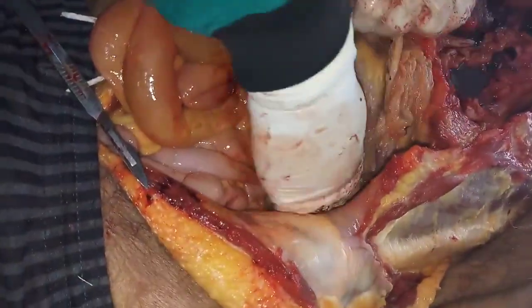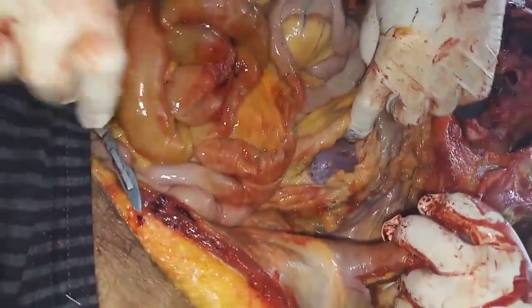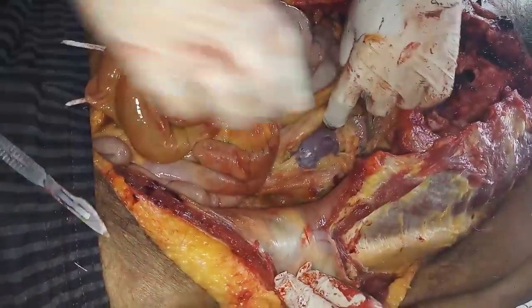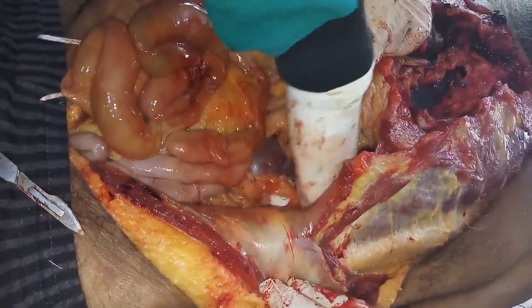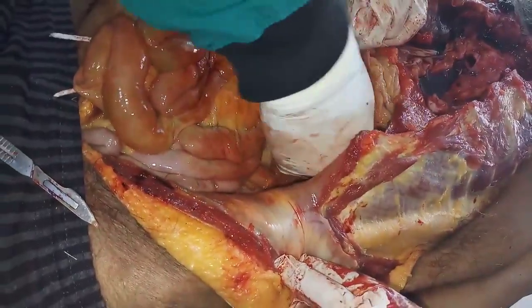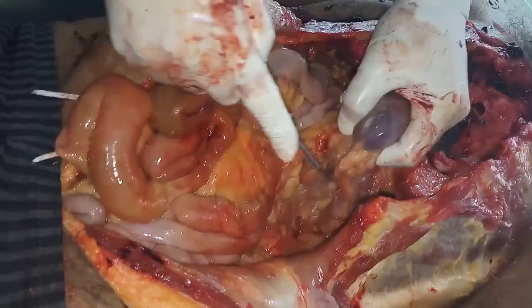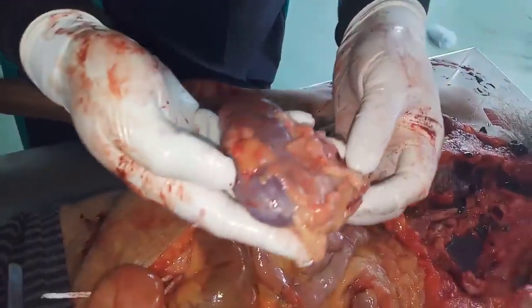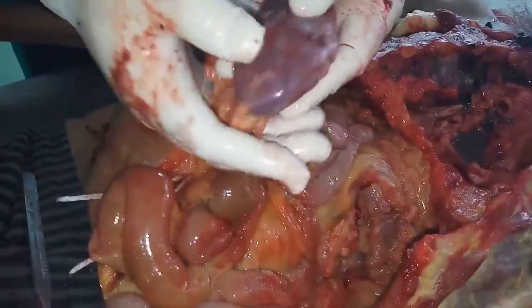So this is the kidney of the other side you can see. This is the kidney of the other side. Again small cysts are there on this surface also. Okay.